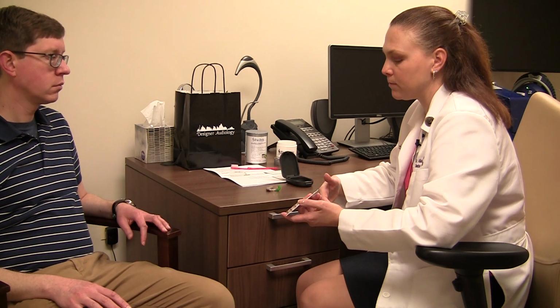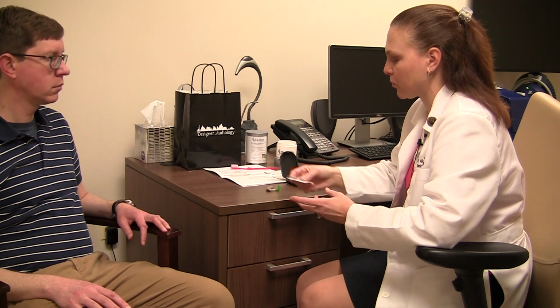You can get batteries anywhere. We have them at the office for sale, part of our battery club. You can get them at grocery stores, Radio Shack, online, wherever you get them. Just make sure they're 13 and they're color-coded orange.